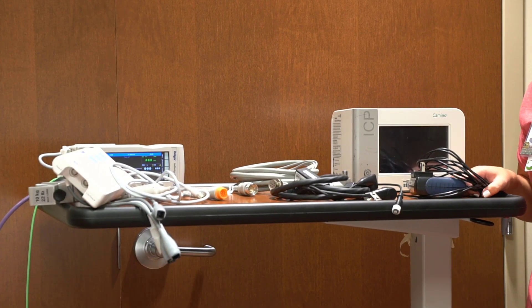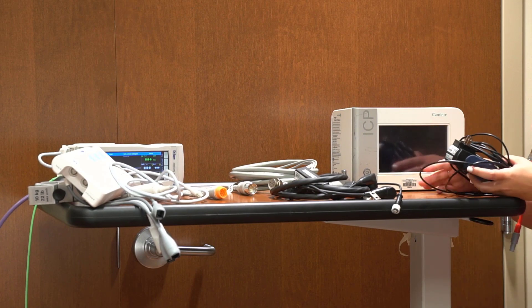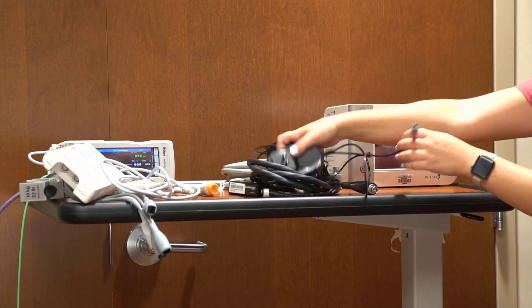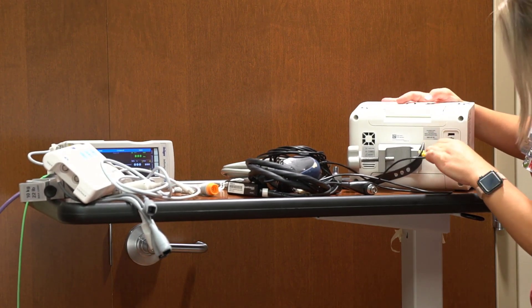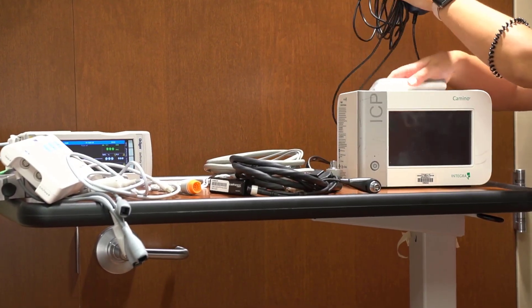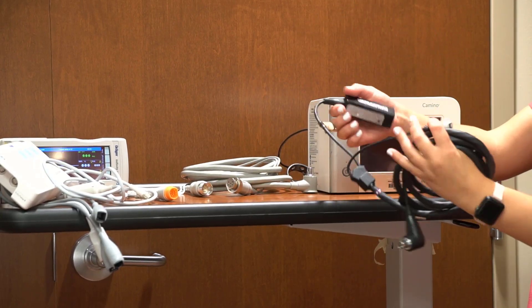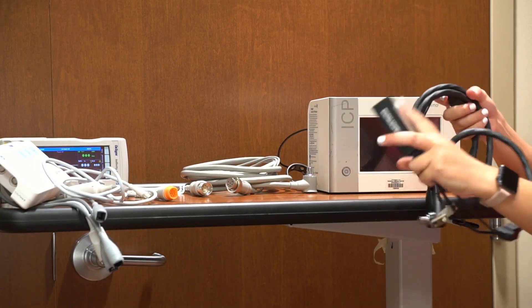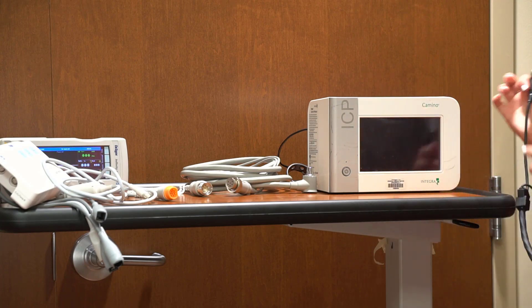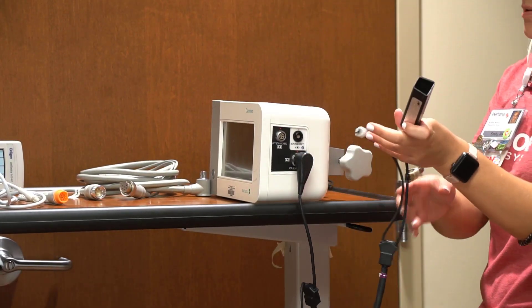My name is Emily Nagel, a nurse on the 2C ICU neuro unit. I'm showing you the cables and monitors needed once the bolt is placed and we're hooking up the Camino. You'll need the Camino monitor and the power cable — it connects to the back and plugs into the wall. Once fully charged it stays charged, and after unplugging you have about an hour and a half of battery life. The black cable connects to the patient; it has two ends — one with a T for temperature, which we don't use, and one with a P, which connects to the side of the monitor.